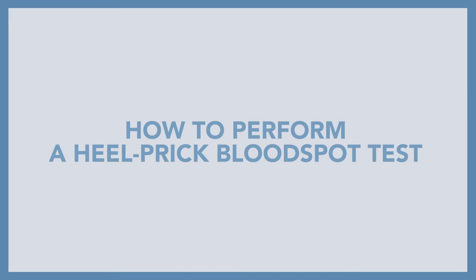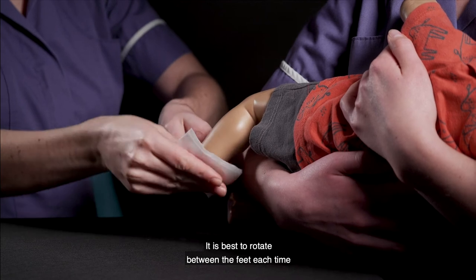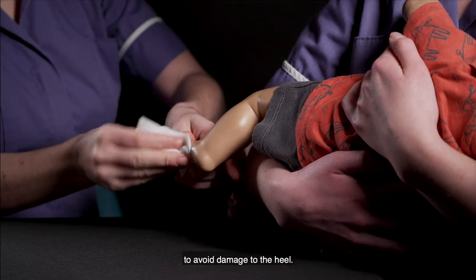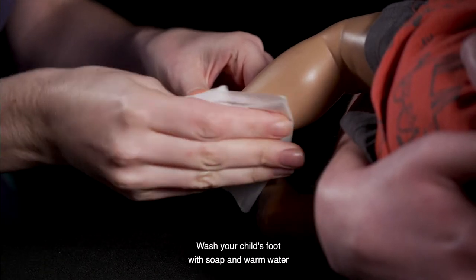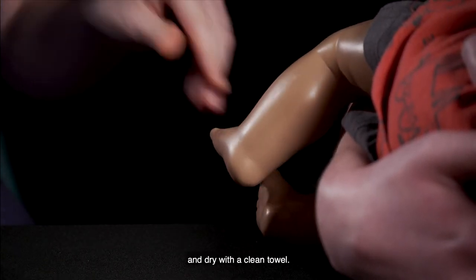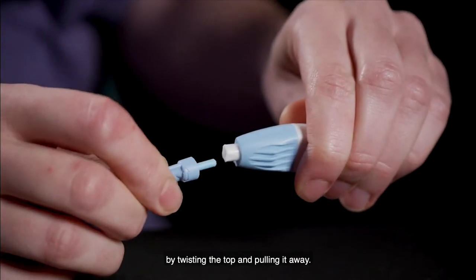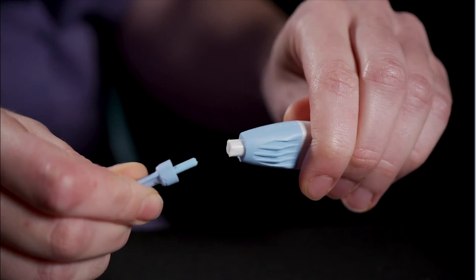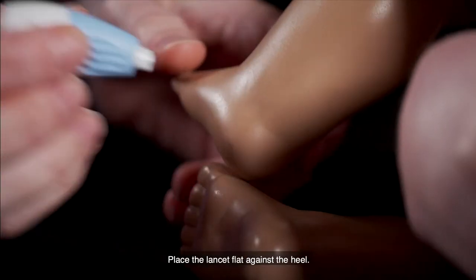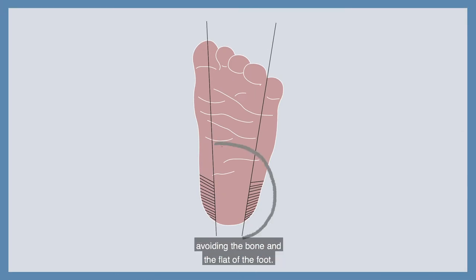Now I'm going to show you how to perform a heel prick blood spot test. Choose a foot — it is best to rotate between the feet each time to avoid damage to the heel. Wash your child's foot with soap and warm water and dry with a clean towel. Get your lancet ready and remove the safety cap by twisting the top and pulling it away. Place the lancet flat against the heel, aiming for the outer side of the heel, avoiding the bone and flat of the foot.